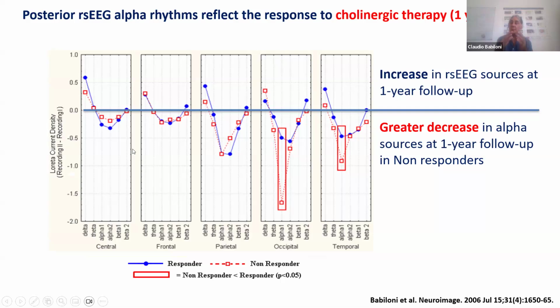In this graph, we represented the EEG source activity in the second recording in the follow-up minus the first recording before starting the treatment.